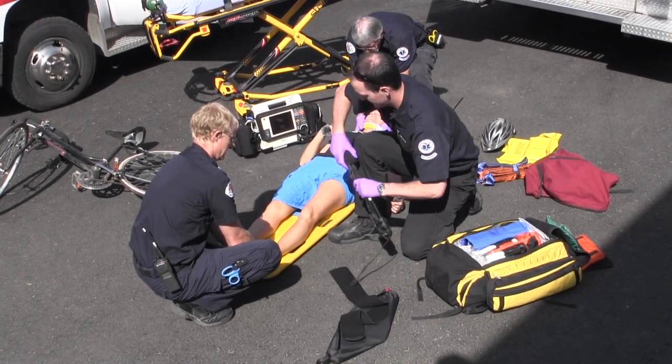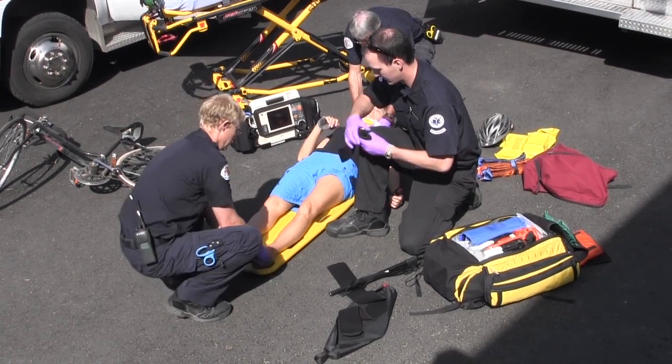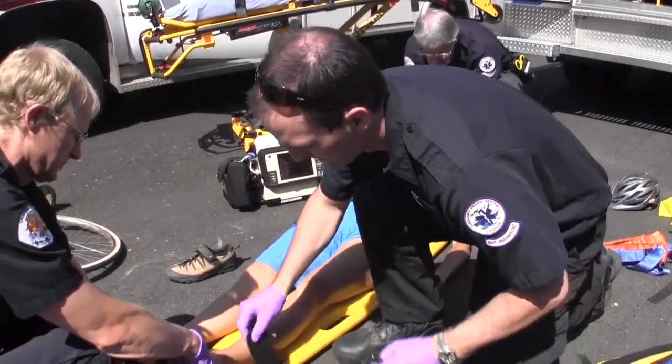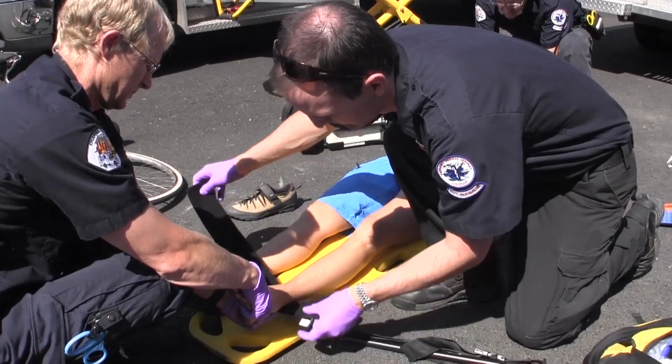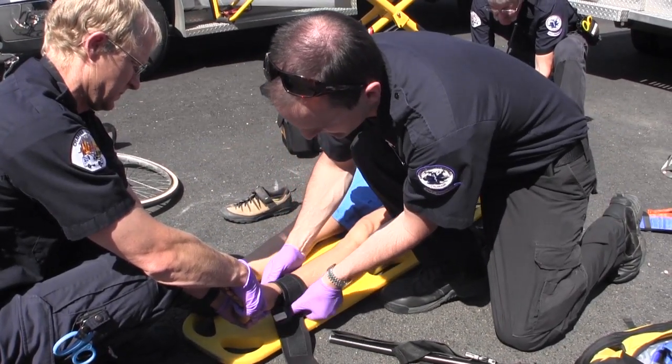The first component applied to the patient is the ankle strap. It's removed from the pole, unrolled, then wrapped comfortably around the patient's ankle. The ankle strap is held securely in place by a large Velcro attachment area.